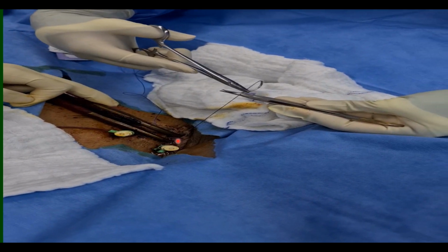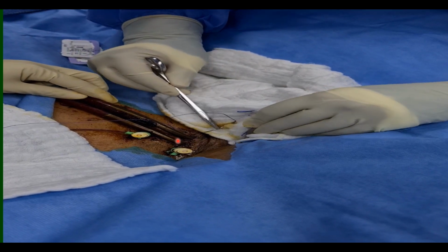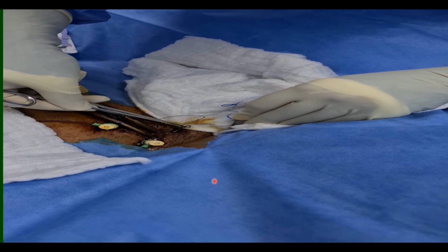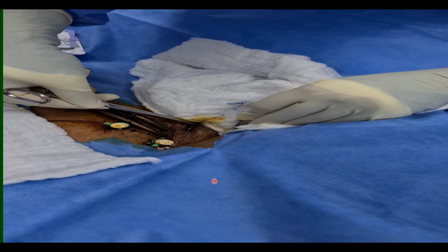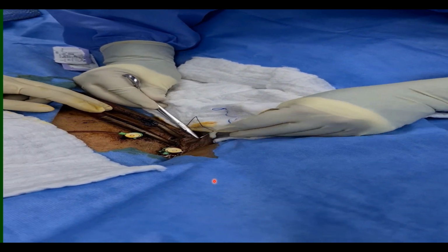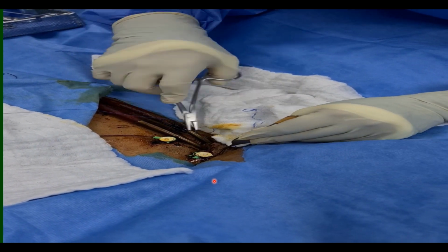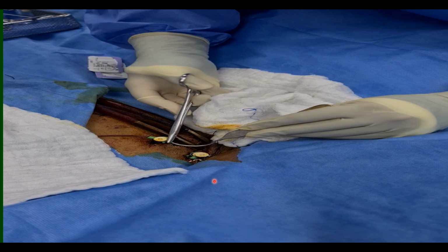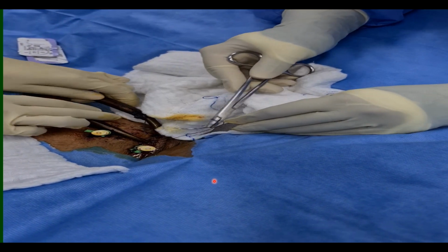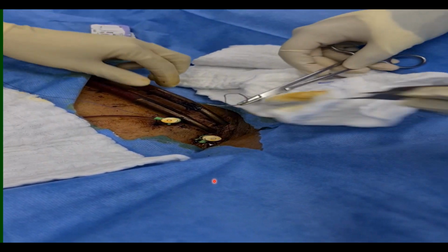Then they clamp the circuit distally, and they start by removing the venous cannula. They take purse-string sutures all around and tie them strongly together. One of them takes the cannula out and the other compresses to avoid bleeding. After removing the cannula, they should be sure that blood comes out, to be sure that there is no thrombus left inside.